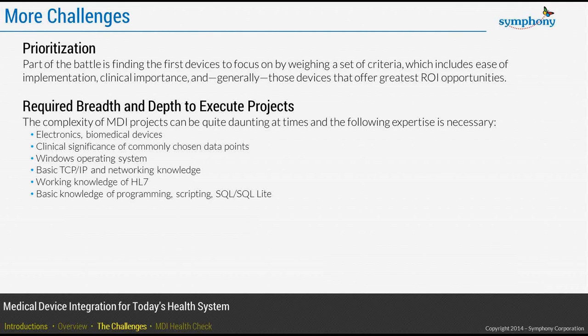Now, the next thing that we have here is required breadth and depth to execute projects. So we're talking about knowledge and expertise. Electronics and biomedical devices. Obviously, you've got these medical devices, and you need the biomed support in order to work with those. Electronics is very helpful from that perspective, as well as because third-party vendors come in with pieces of hardware that are part of their solution.